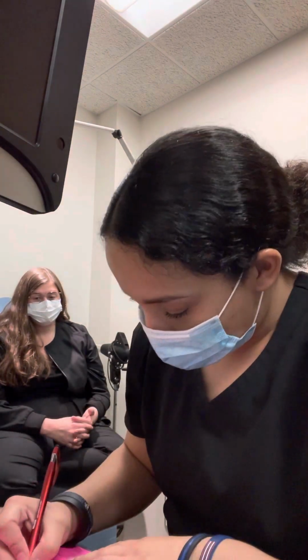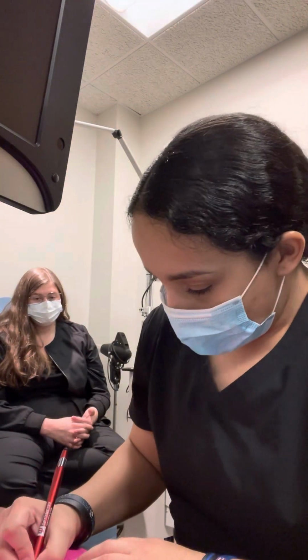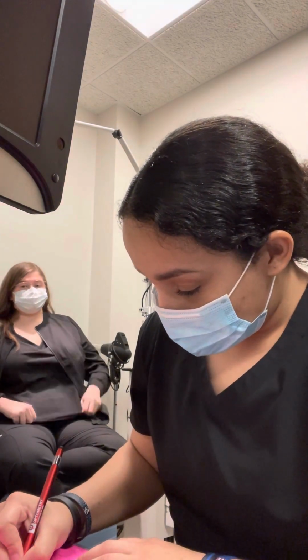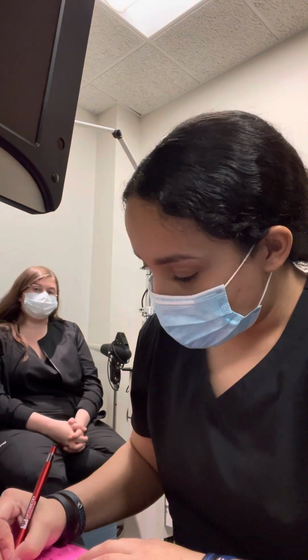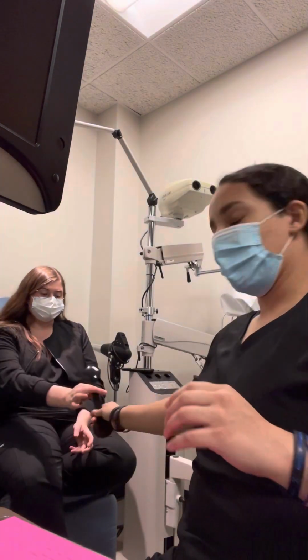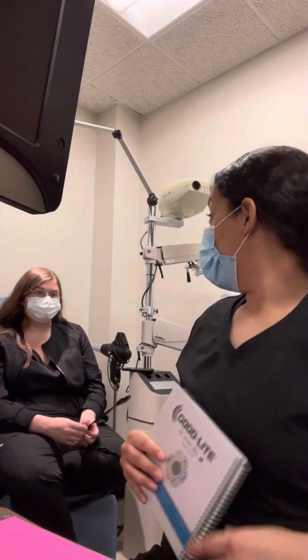Okay, so for a near point of accommodation, she was 7 centimeters in her right eye, 7 centimeters in her left eye, and 7.5 centimeters in both her eyes. Alrighty, Ms. Barber. Actually, I'm going to hand this back to you. Next, we're just going to be checking your color vision, okay?